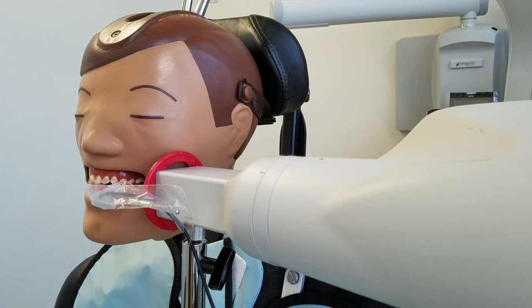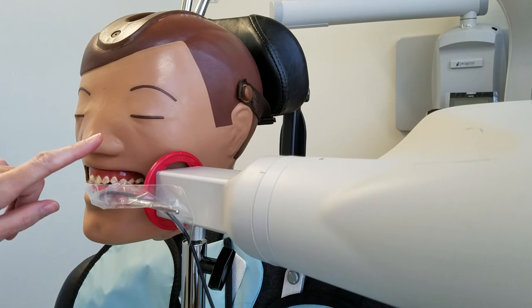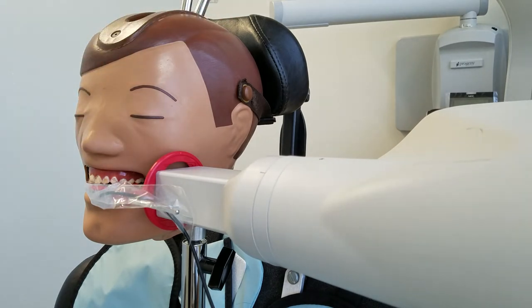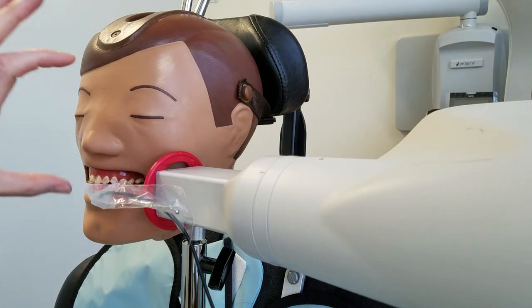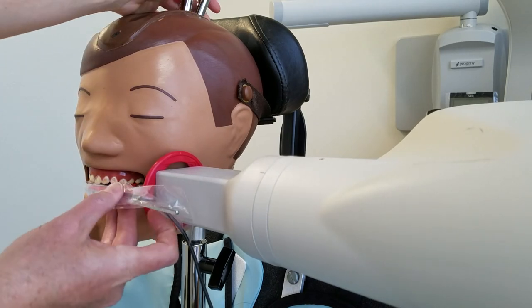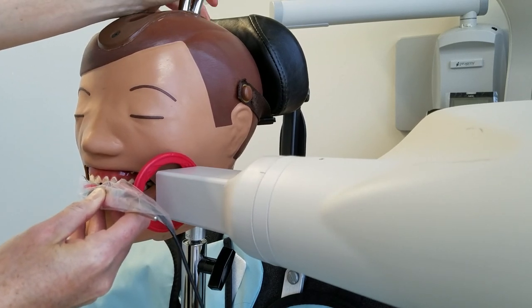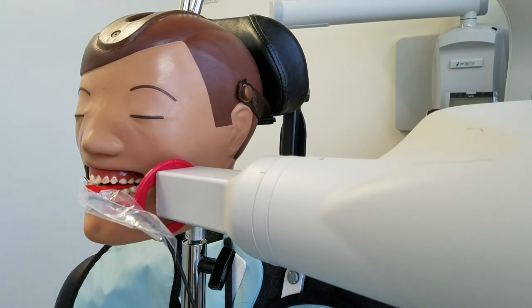It's good for practice and to understand basic placement, but these can sometimes give us a little bit of trouble. We do have to find the perfect place to position the sensor for Dexter to bite on. This is roughly what it should look like. I did take the picture and my contacts are a little bit overlapped — when I compensated for good placement my horizontal angulation closed, so we may need to open the contacts but risk a placement error, or vice versa. I brought it forward a little bit, which allowed Dexter to bite on it more evenly. So that's the molar placement.